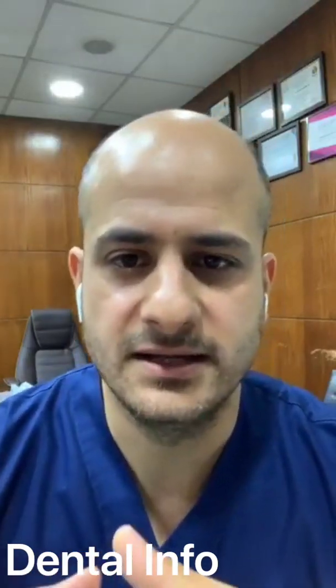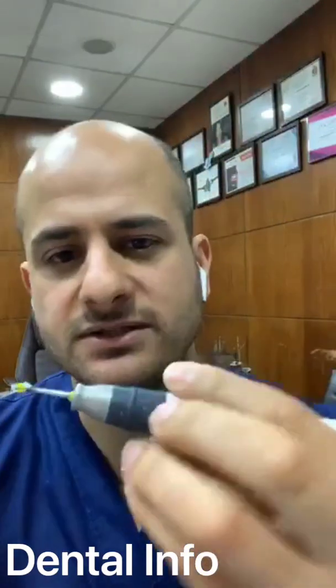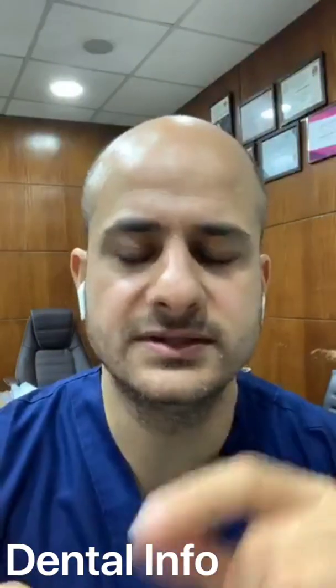Where's the question? How to avoid having voids after obturation? Dr. Dima, I think I answered your question. You have to fill it incrementally. So when you are using the backfill device, try to fill the canal incrementally, not in one shot, and make good condensation with your cold plugger. Some people make condensation with their heat delivery device. No need to make that. Make cold compaction, not heated compaction.